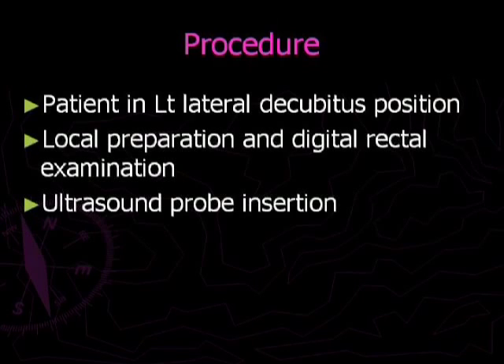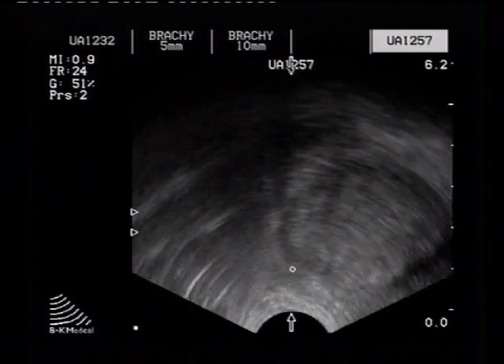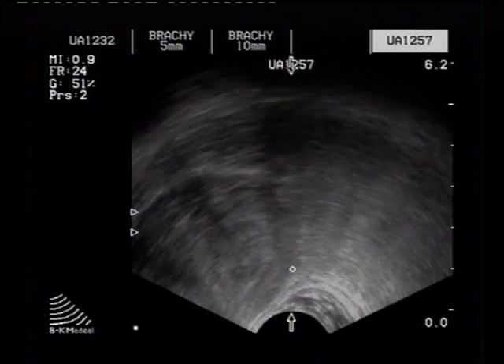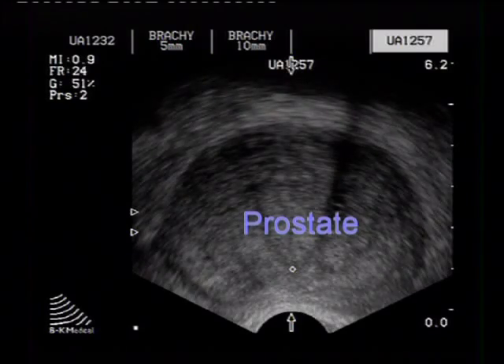The patient is placed in left lateral decubitus position and an initial digital rectal examination is performed. The transrectal ultrasound probe is then gently inserted and the prostate is initially evaluated for identifiable pathological conditions.